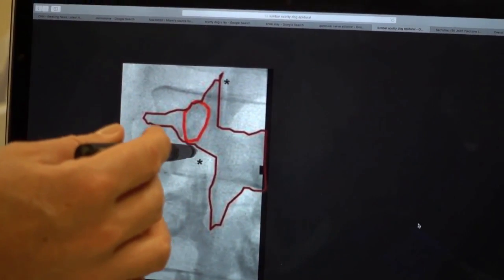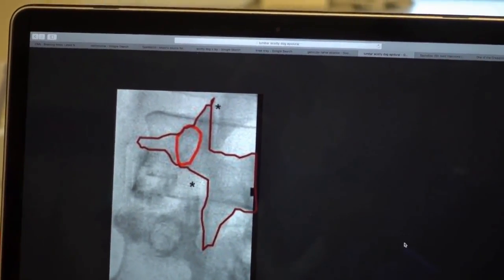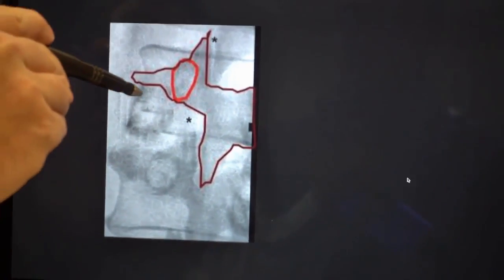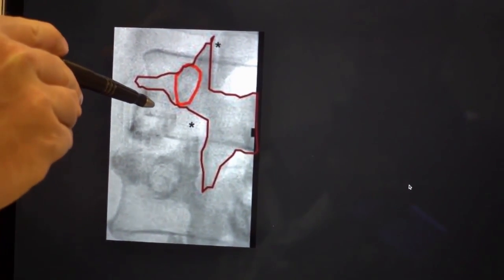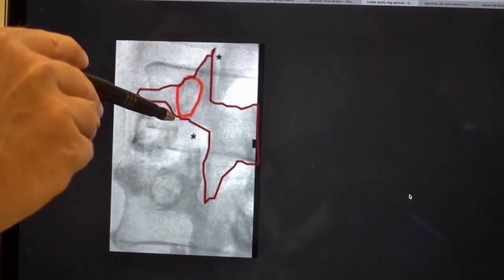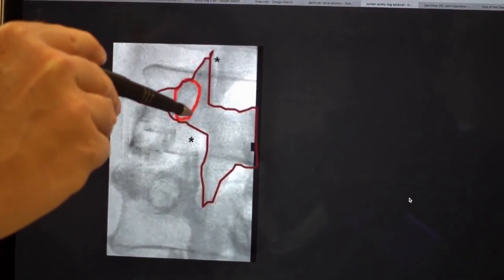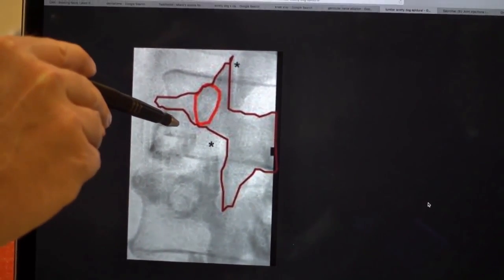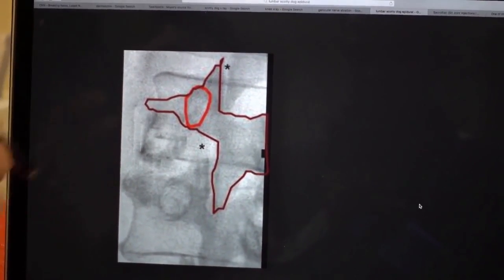And so this star is where you don't go. That star represents probably dead center path of the nerve. If we're to place the needle, we'd probably get this projection, then we'd numb up the skin right here or here. Then we'd walk slowly over and we'd put the needle right under the pedicle, and the nerve would be coming right here, so we'd be lateral to the nerve and hopefully lateral to the arteries.